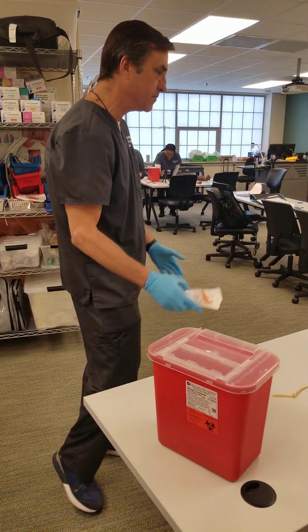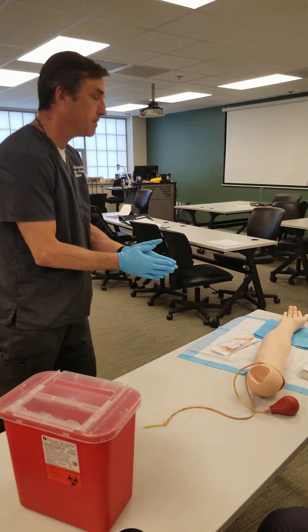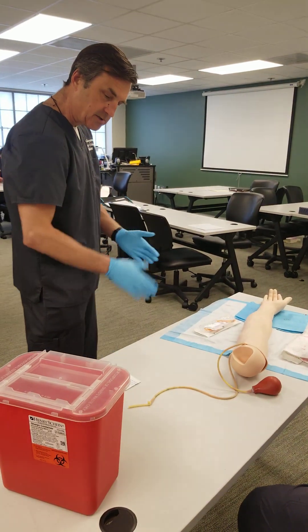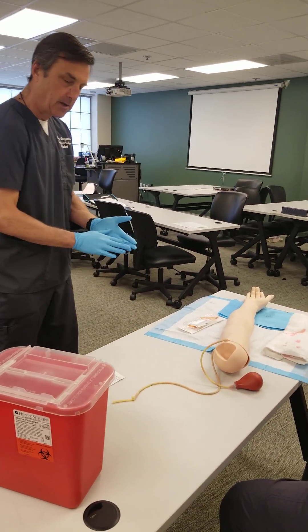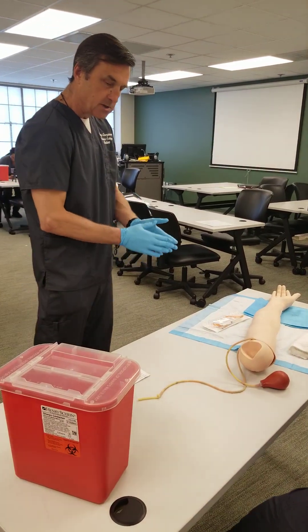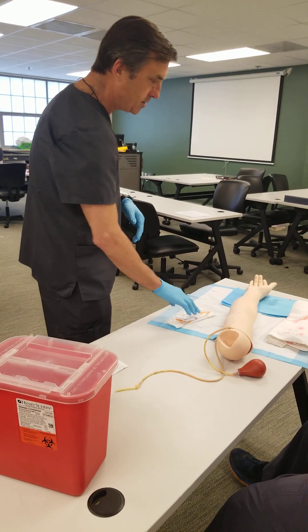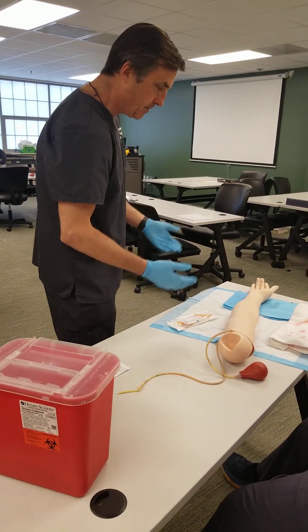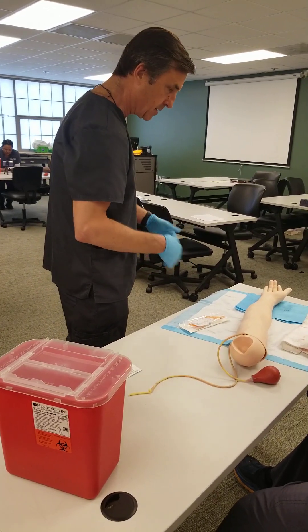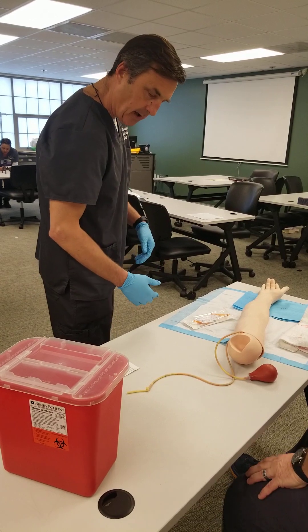I'm going to walk into the room with my equipment and introduce myself. My name's Tom with respiratory therapy. Mr. Johnson, can I have you state your full name and birth date please? Your doctor has ordered an ABG — arterial blood gas — today. That'll give us a better indication of what might be problems with the disorder you have.